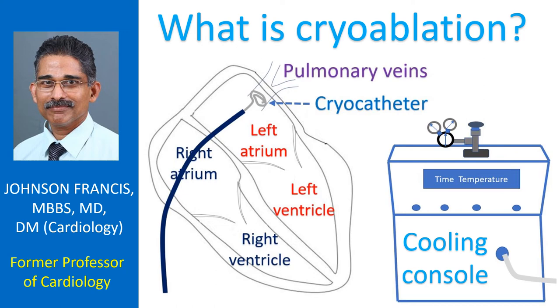Cryoablation is a method used to treat heart rhythm disorders by freezing the abnormal region using a cryoprobe at the tip of the cryocatheter. While radiofrequency ablation (RF ablation) removes an abnormal region or pathway by heating up the cells, cryoablation does the same by cooling the cells to sub-zero temperature. Currently, the cryocatheter is much more expensive than the radiofrequency ablation system and is not as widely available.